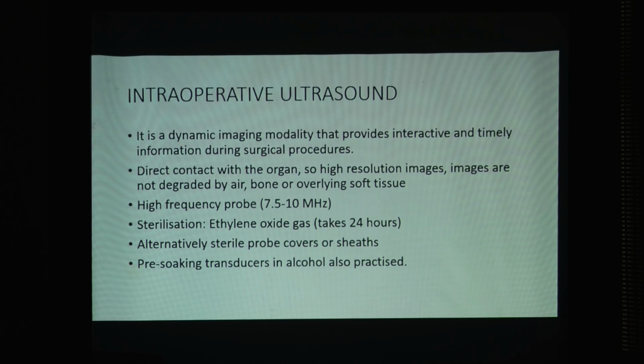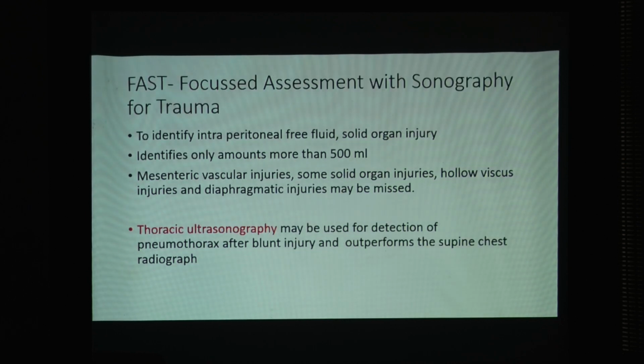Ethylene oxide gas is used for sterilization but takes more than 24 hours, so only 1 case per day. Alternatively, sterile probe covers and sheaths can be used. Then pre-soaking transducers in alcohol is practiced.